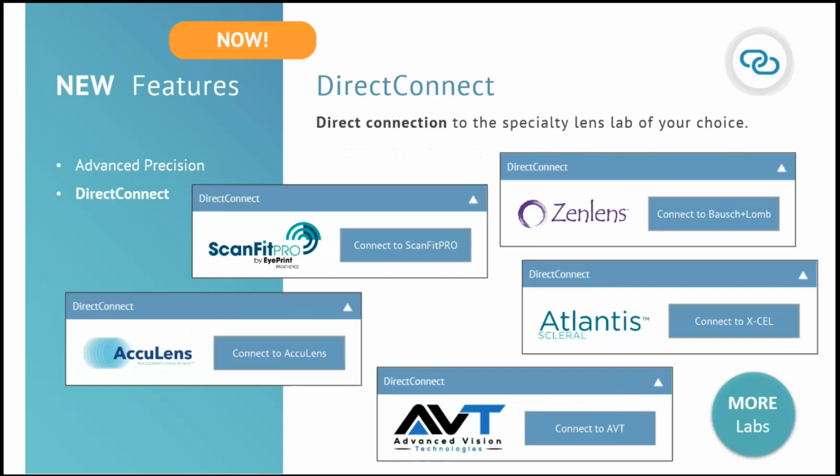So we are now connecting with Bausch & Lomb, also for the ScanFit Pro, also with Xcel, with AccuLens, and with AVT. So all these 5 labs together with Boston Sight and Blanchard gives probably 90-something percent of the lenses you are using. And of course, the few labs missing will keep on coming for the next release. And so now we really hope that for most of your orders, you have a little bit of help within the ESP to make it happen a bit faster.